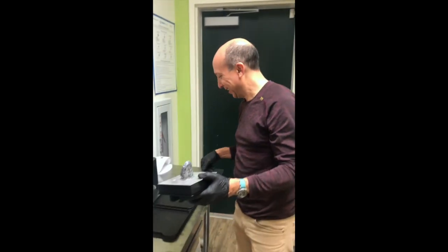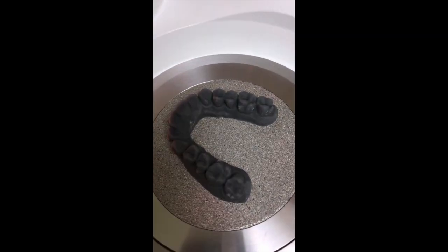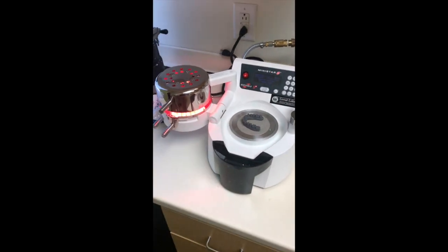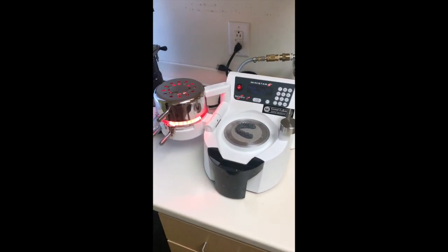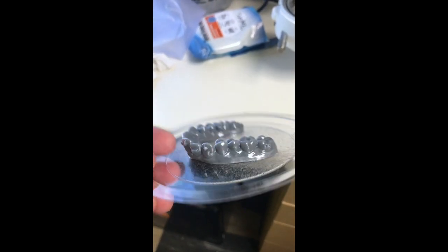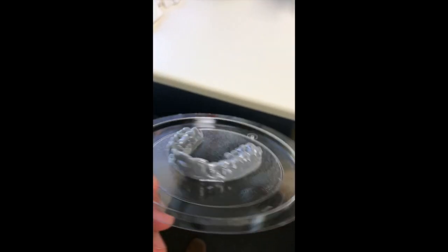We're going to make her aligner soon. We've got our model now — pretty model — and we're going ahead and make our first aligner. Turn it over, and here is the model after we've got our aligner material around it. Now I'm going to separate it. You can see our attachments around it.